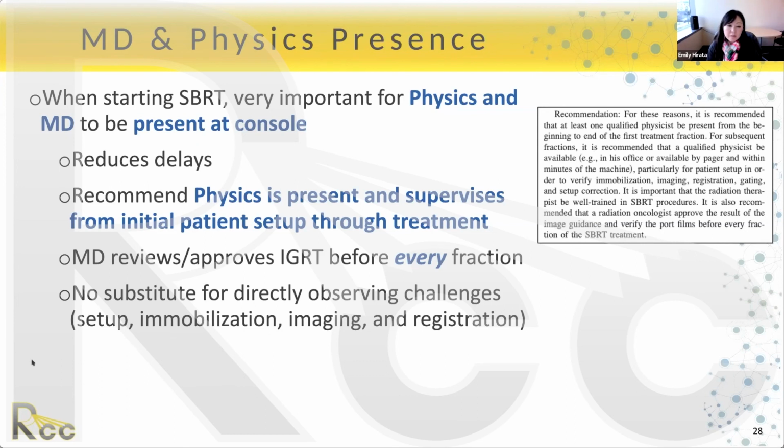And I just want to emphasize again, there's no substitute for directly observing the challenges, whether it's the therapist's setup, immobilization, imaging, registration challenges, all of that. Being there really, really helps a lot. It can be time consuming and require a lot of coordination, but I really want to encourage that SBRT practices have physics there, especially when starting out, from the beginning through the end of that treatment.